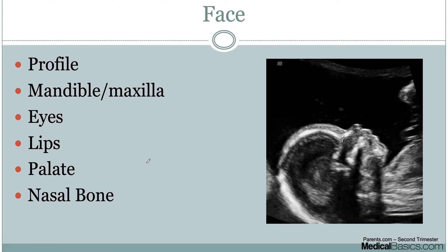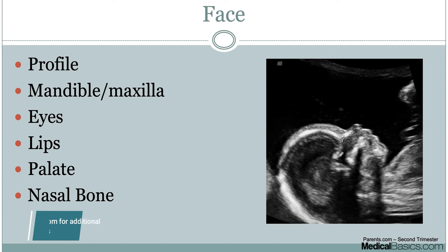Next, and very importantly, is looking at the face. Facial assessment is important because it keys you on to other abnormalities — many trisomies are associated with facial abnormalities. You want to make sure all structures are present: a good forehead, nasal septum, nose, lips, and chin. On other projections, you verify the mandible and maxilla, confirm two normal-appearing eyes, and very specifically look at the palate. Any abnormality of the palate or lip predisposes to various conditions and may prompt looking for other abnormalities. You also check for the presence of a nasal bone, which is measured on ultrasound.